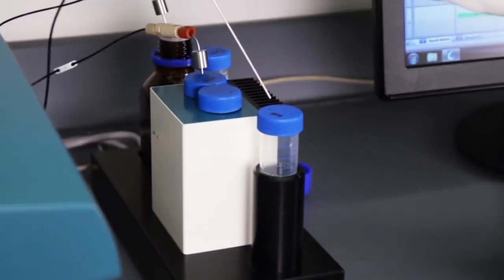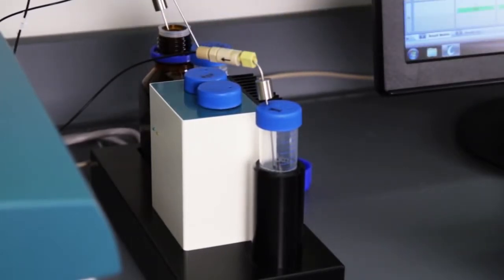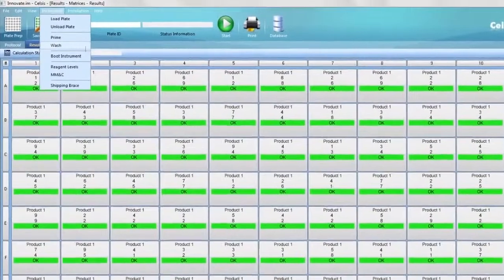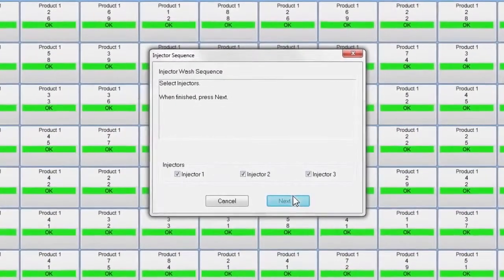When testing is complete for the day, transfer the injectors into the washing solution, and initiate the wash cycle. Injectors are left in the washing solution overnight, or until the next testing cycle.